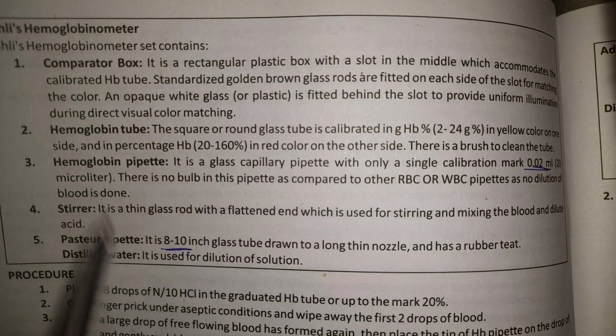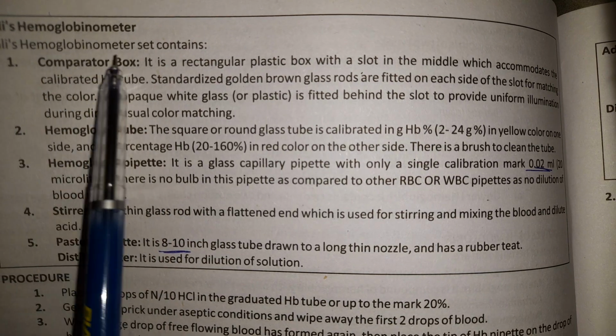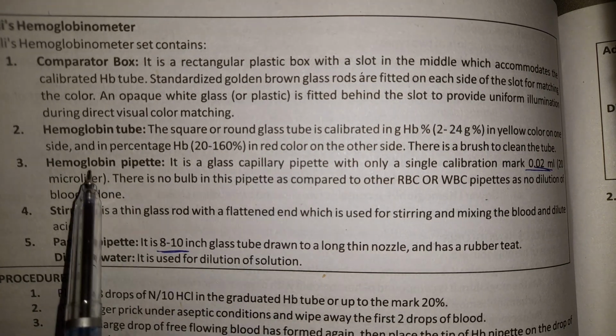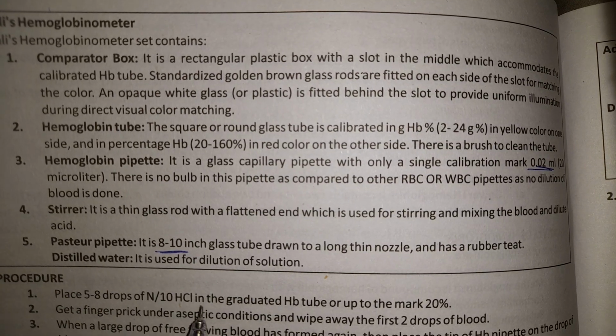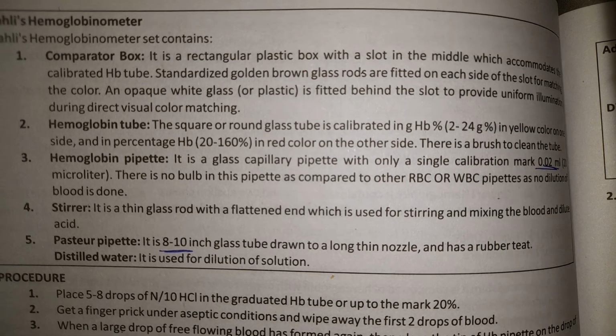So coming towards the Sahli's hemoglobinometer, we have the comparator box. I will show you in a moment. Then the hemoglobin tube. There will be a red color bead in it. Then the hemoglobin pipette, then a stirrer, a Pasteur pipette, and distilled water. Also N by 10 HCl will be required. And there will be a graduated hemoglobin tube.